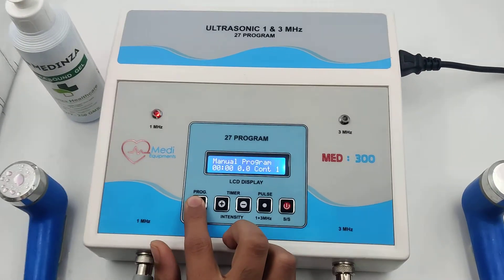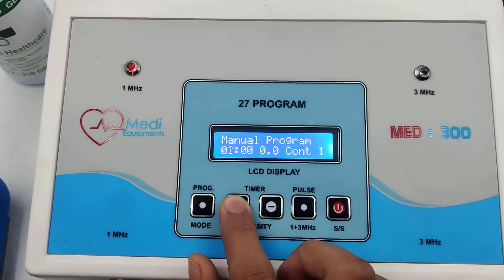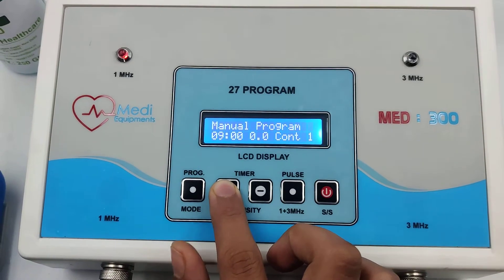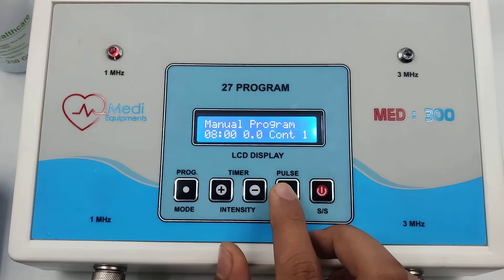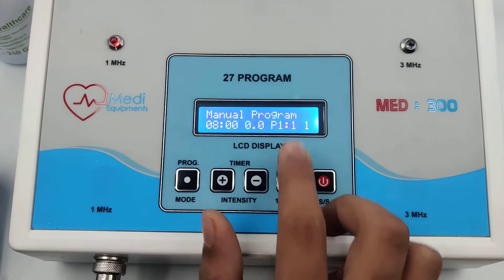Press the mode button. Now set the timer as per your need — timer up or timer down. Now select the mode as per your need: continuous or pulse. This is continuous, and this is pulse.